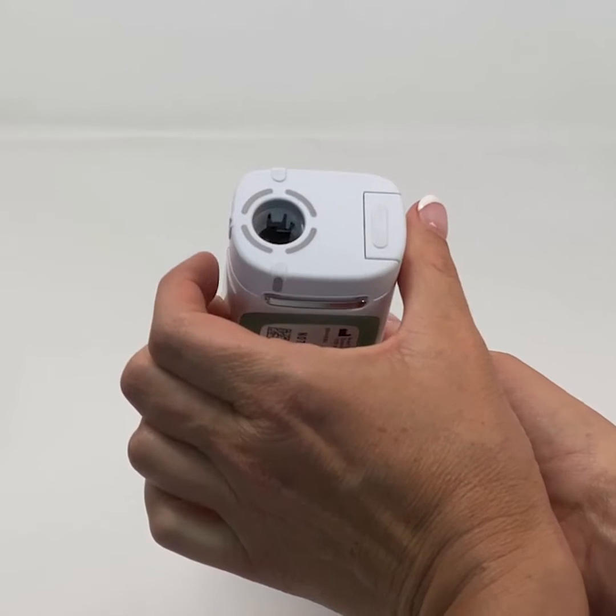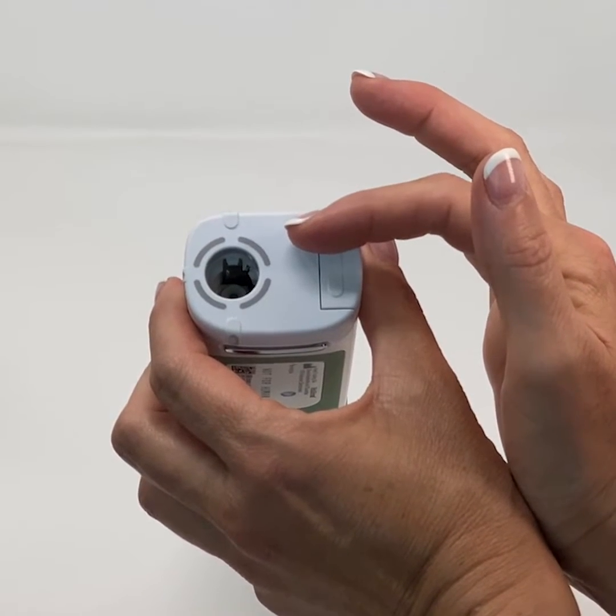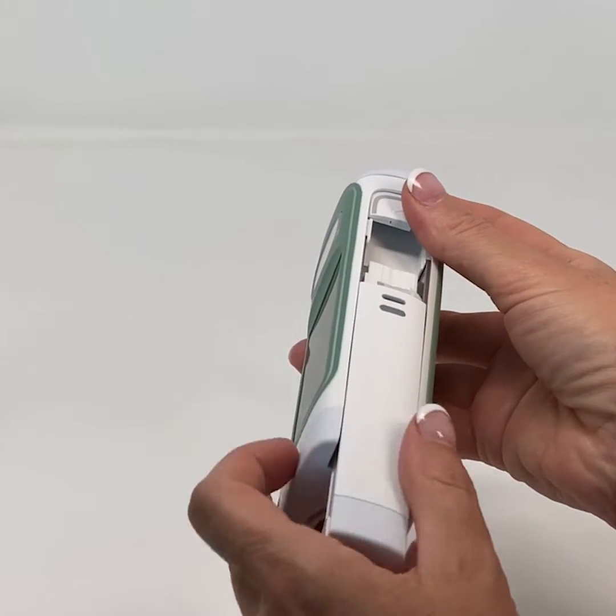The skin sensors around the needle cavity detect if the device is positioned correctly onto the skin. You can remove the battery to charge it, or charge the battery outside of the device.